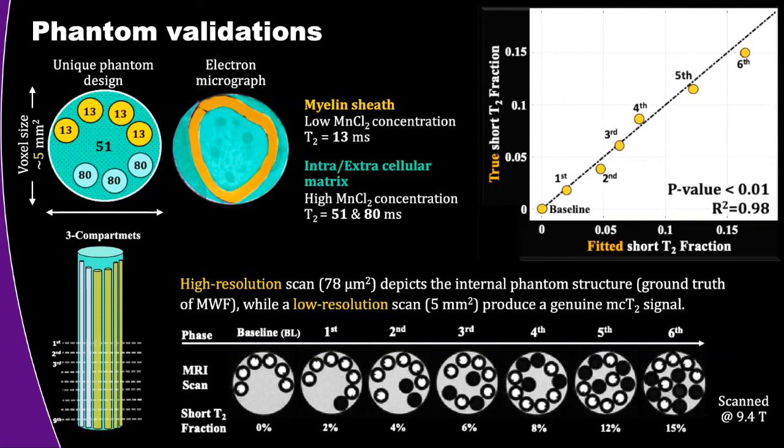Yeah, I see. I think I understand that part. I guess the question is, if we're talking about the GRE-based approach, as you said, it will be the T2 star model, right? We all know that the T2 star has the components of T2, and this T2 prime, which is due to B0 inhomogeneity. I guess the fundamental question is, how well can we assume that the T2 prime is the same for both myelin water and the free water components? Is it the ultimate limitation of it?